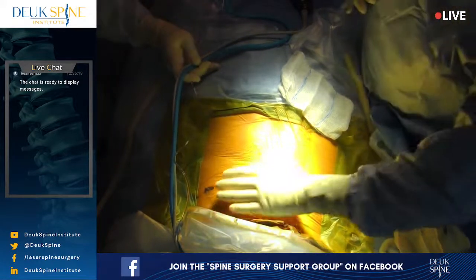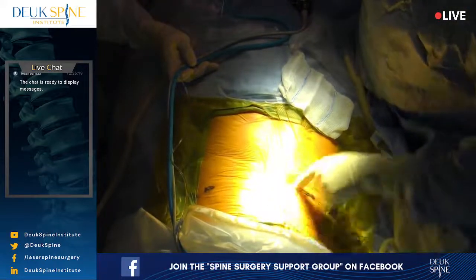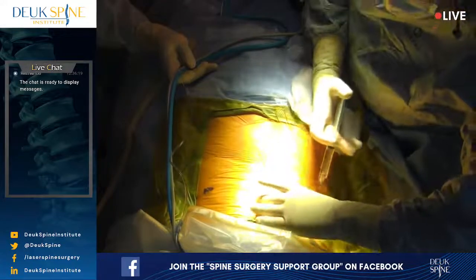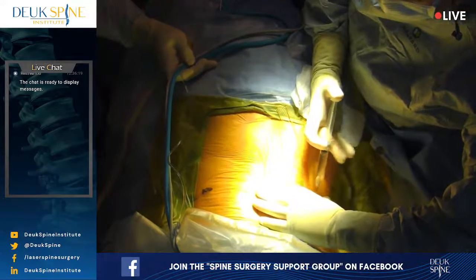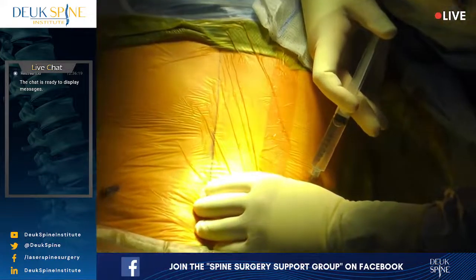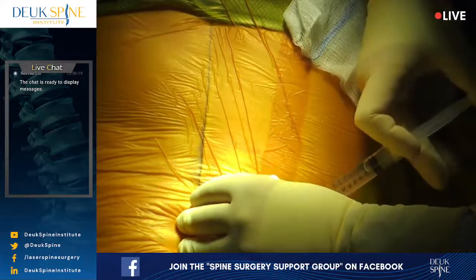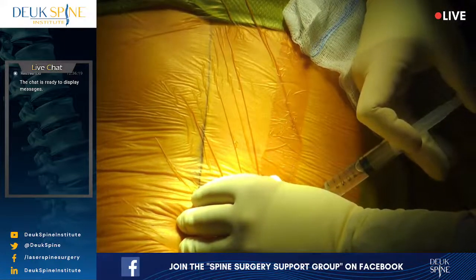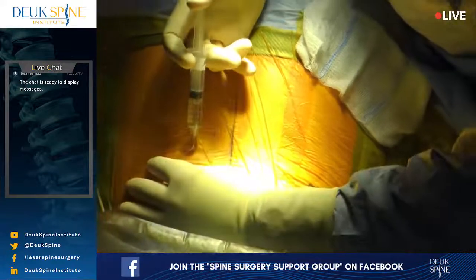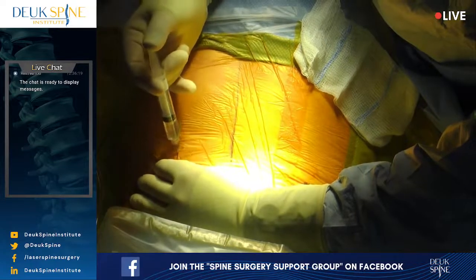It's Dr. Deukmedjian. Are you okay? I'm going to give you some numbing medicine, all right? You won't like it. You'll feel a little poke and a burn, but just bear with me and lay still, and it'll get better in just a minute, okay? I apologize that it's uncomfortable. We're giving local, which every surgeon does in every surgery pretty much. Little poke. I know it's uncomfortable. Just bear with me for a moment while I numb things up, okay? I apologize.